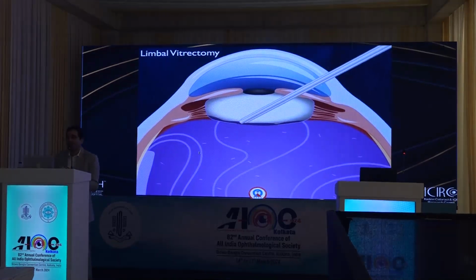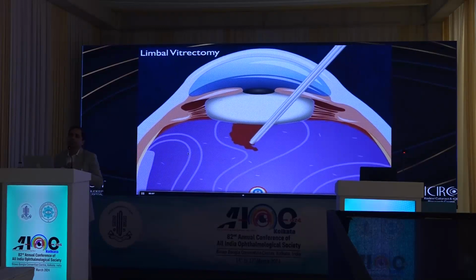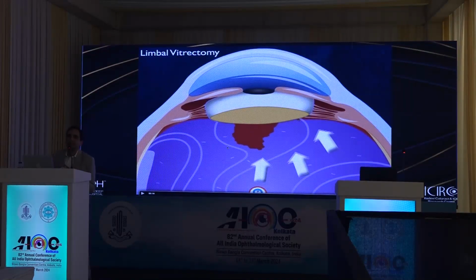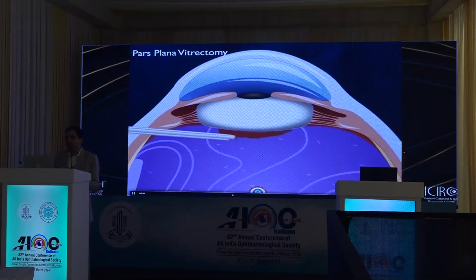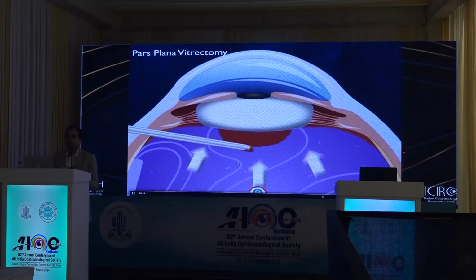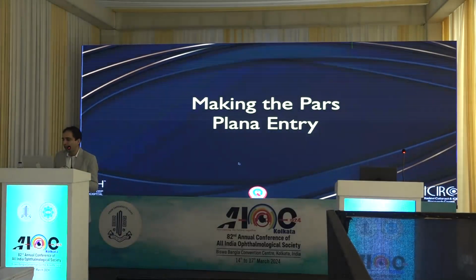Like Dr. Megur showed very nicely how to approach it face down, the only limitation with the limbal approach is that in spite of changing hands, the ergonomic access is generally limited, and therefore there are chances of leaving behind unequal pockets of vitreous around the area of the PCR, which may lead to some tilt of the IOL in the post-operative period. Compare that to the pars plana approach, where the ergonomic access is much easier. You're just moving your right hand, and remember it's only 3.5 millimeters away from where you're already working. So it should not be too much of a big deal.